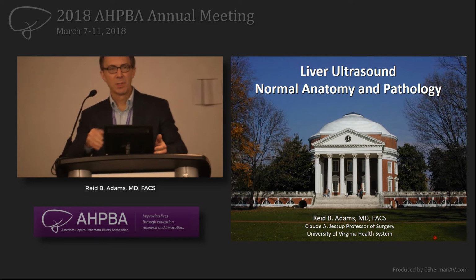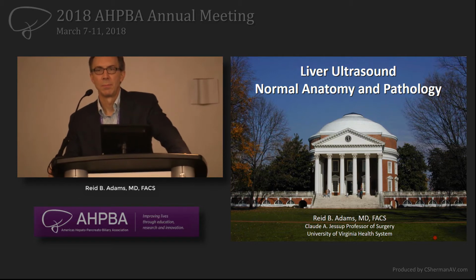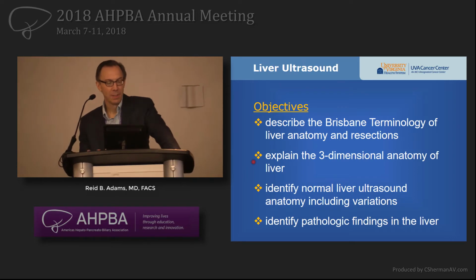You guys probably did this at the beginning. I wasn't here at the very beginning. How many people are beginners at ultrasound? Okay, so a handful. How many are experienced at ultrasound? All right, so the rest are in between, huh? Okay. All right. So I have nothing to disclose for this talk.